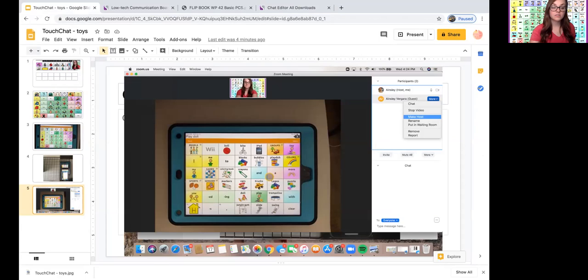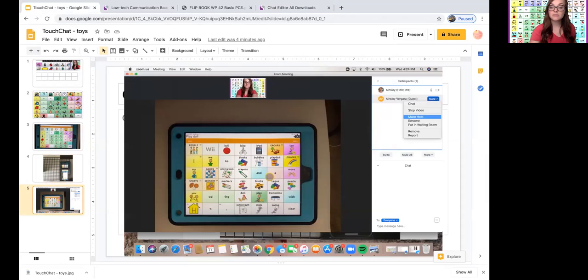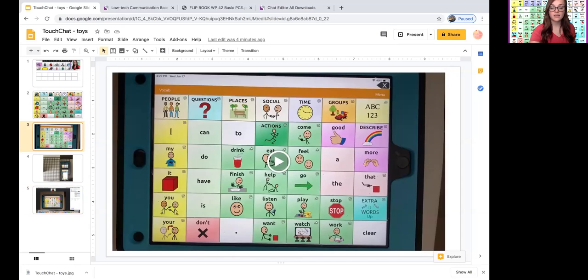After I place it like this, I log into my phone with the same Zoom account, and so I'm just showing up as two users. And then sometimes I have to assign myself as the host. So if you go into the participants and click on your second device, so your phone, you can click more and then choose make host to make sure that it's showing up as the main video. So here's a video of how I use my phone as a document camera.